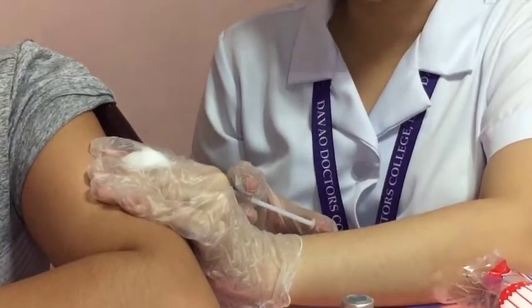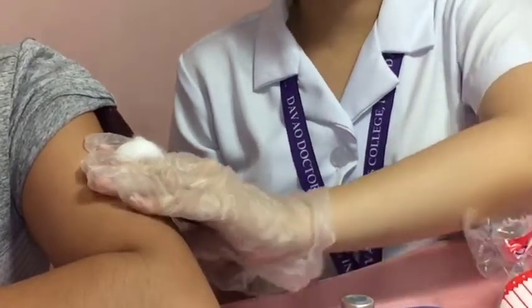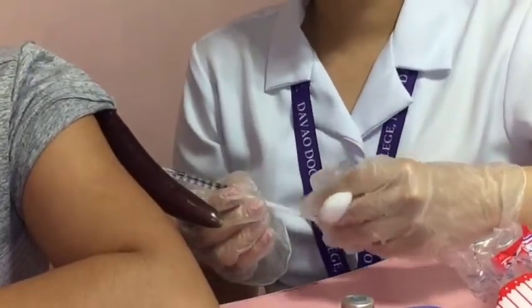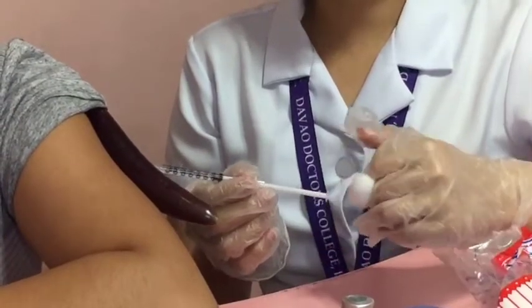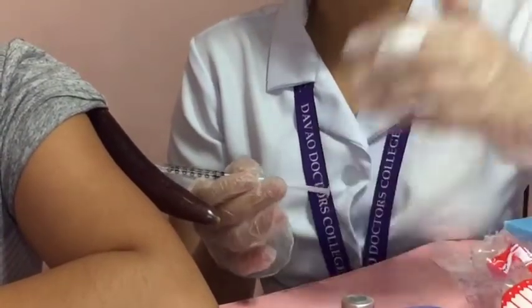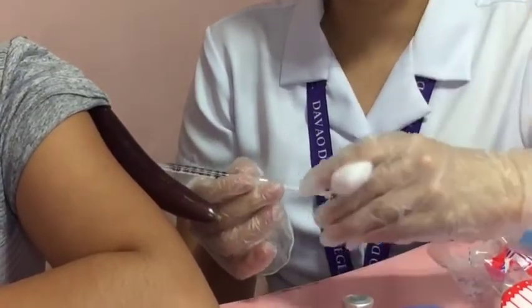Now when the needle is inserted, move your non-dominant hand to the end of the plunger. Hold the syringe steady and inject the medication at even pressure to minimize the discomfort of the client.